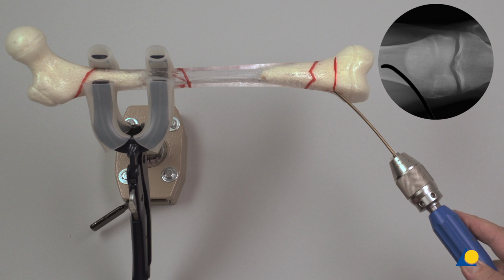Clinically, the position of the nail tip is checked under image intensification. The laser marking on the nail end indicates the nail tip alignment. This facilitates nail insertion, helps to reduce the X-ray exposure time, and prevents excessive crossover of the nails, also known as the corkscrew effect.